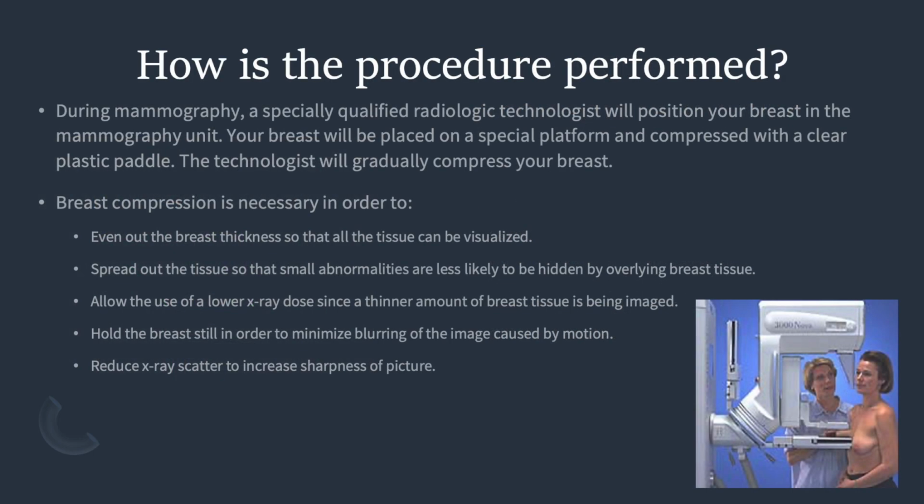How is the procedure performed? During mammography, a specially qualified radiology technologist will position your breast in a mammography unit. Your breast will be placed on a special platform and compressed with a clear plastic pad. The technologist will gradually compress your breast.